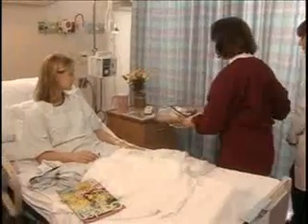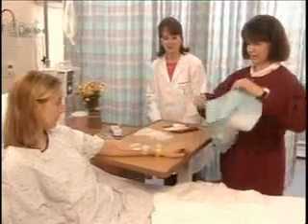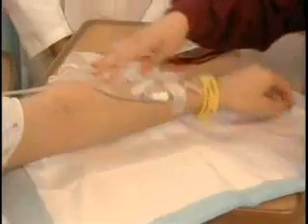Okay. Could you put your arm up on the table for me? Sure. Now I'll place this towel underneath your arm. Great.